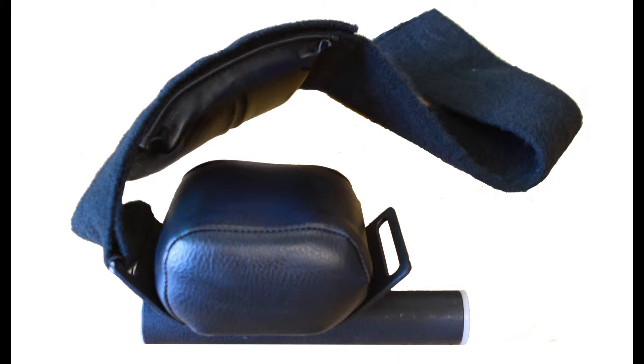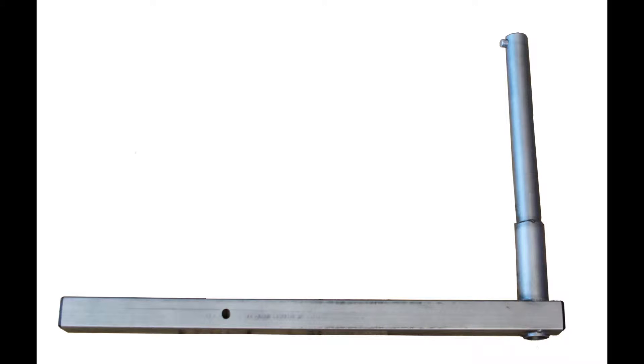For knee flexion and extension we will need the knee stroke hip pad and the knee hip adapter. These are often left attached to one another.